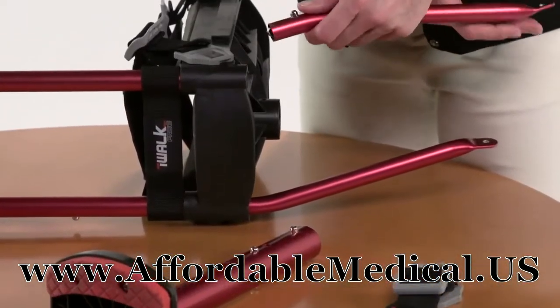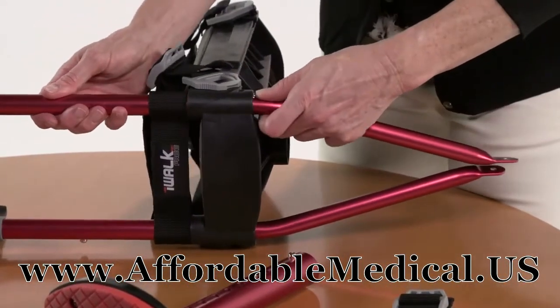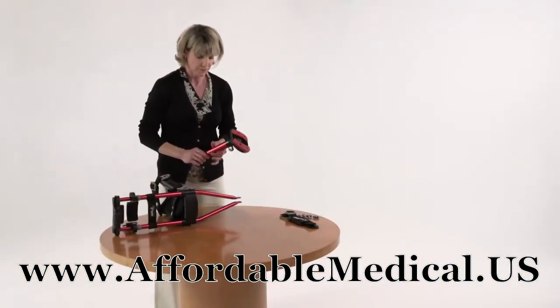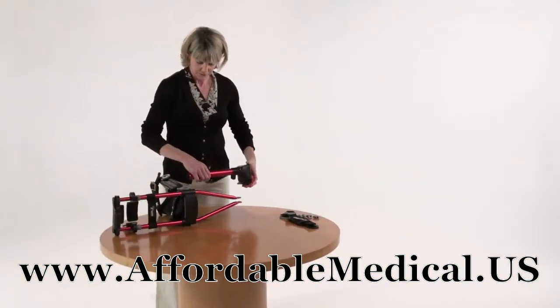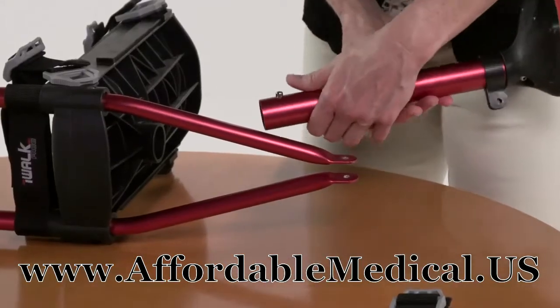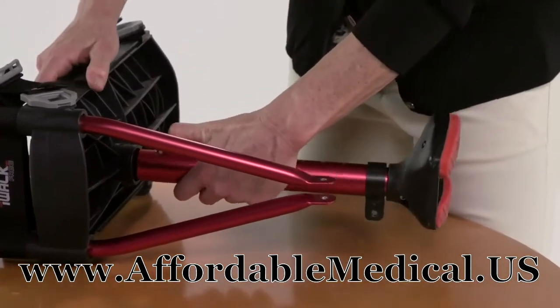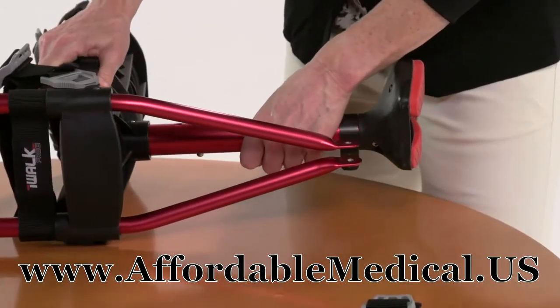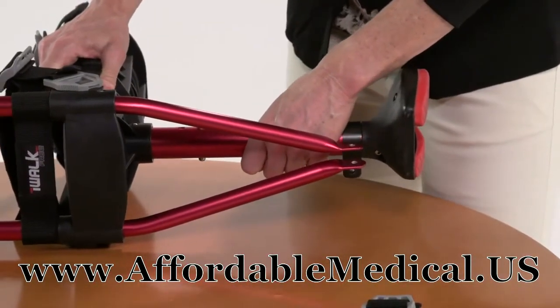Then do the same thing with the left support tube. Now put the lower assembly into the large socket of the knee platform — it snaps in the same way. Just push in the spring head and insert the tube into the socket. Pull on it to make sure it won't disengage.